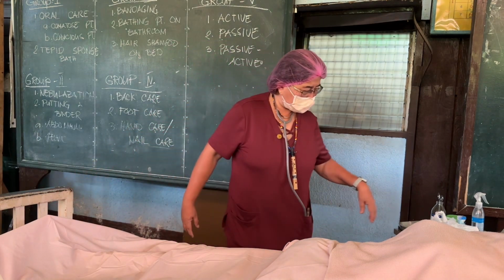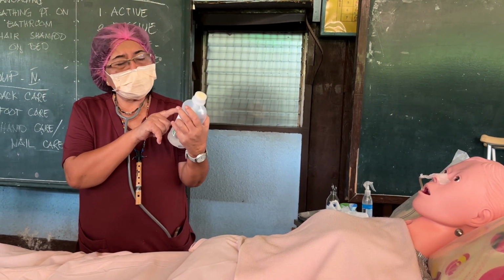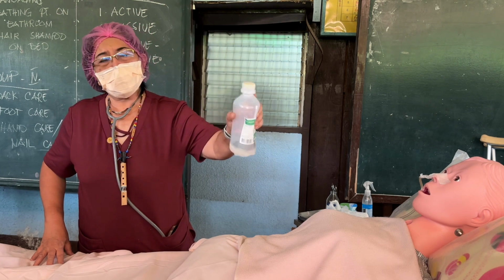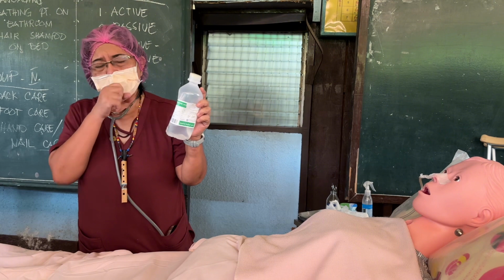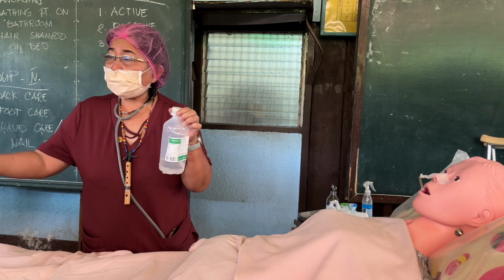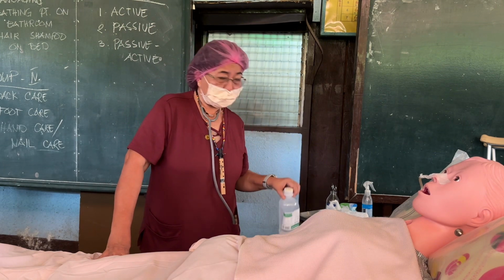So this is a normal saline solution, class. 0.9 sodium chloride. It has no glucose, no presence of sugar. It is plain normal saline. But don't be complacent, don't rely on the green label, check that it is 0.9, because a different company has a different color. This is the doctors' favorite for flushing and irrigation because it's safe.